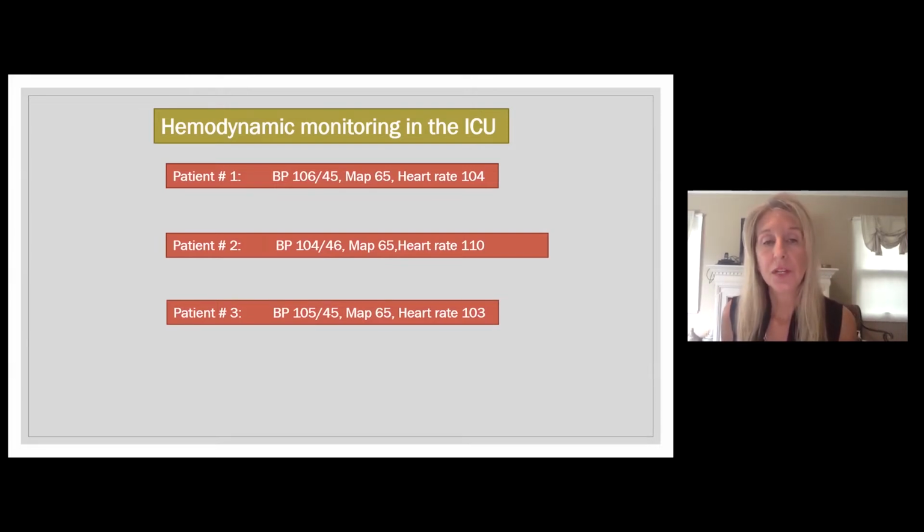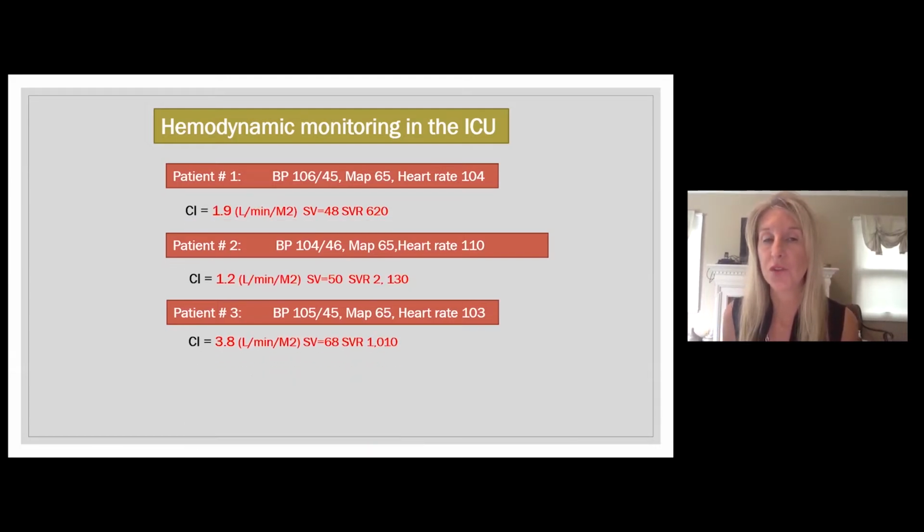But these 3 particular patients happen to have an arterial line, and I was able to use a minimally invasive device, the FloTrac, to get a look at those behind the scene hemodynamic parameters. And this is going to tell a very different story. So let's take a look at patient number 1.